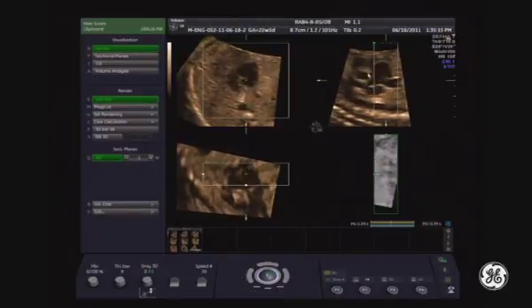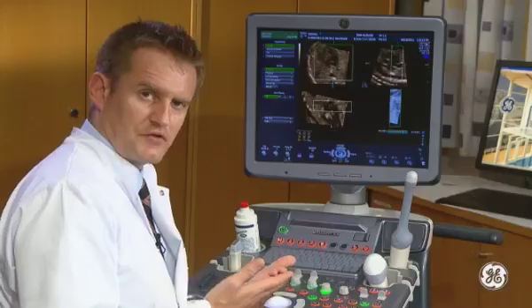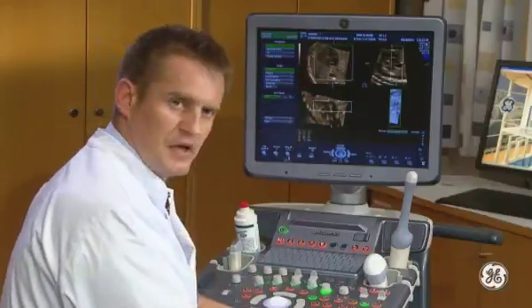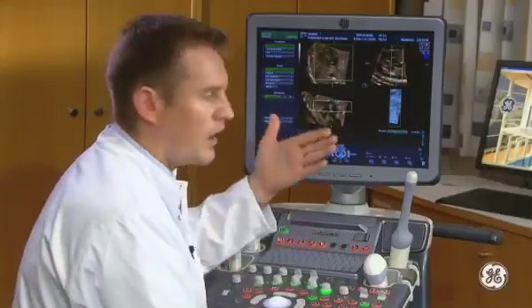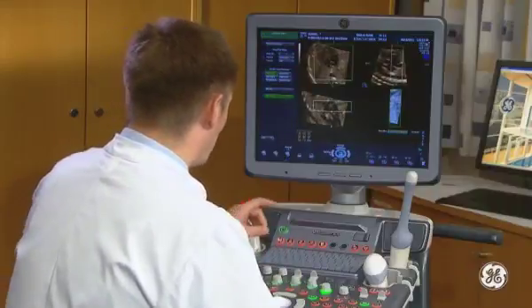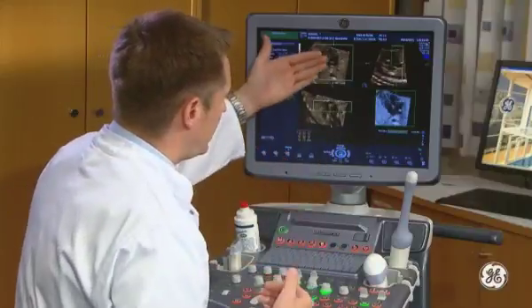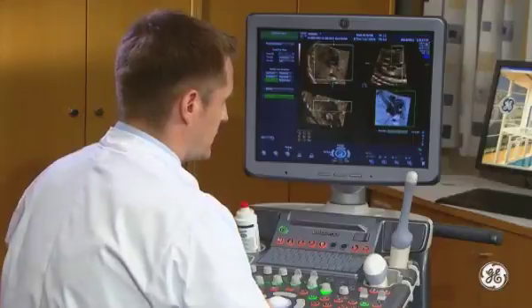So next, the direction of rendering has to be changed, because here we have the direction up to down, which is typical, for example, for baby facing, but for the heart it won't be so helpful. So I will change the direction now into front to back, because that will cause the A-plane to be presented in the rendered image.